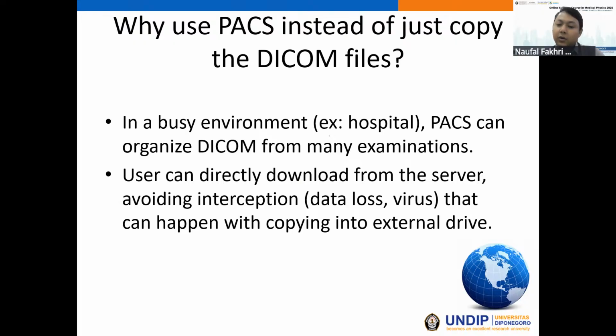This is very good for archiving many records from historical examinations from the past. And the user can directly download from the server. This avoids interception, data loss, data corruption, or a threat from a virus, which can happen when copying to an external drive, for example a thumb drive or external hard disk.